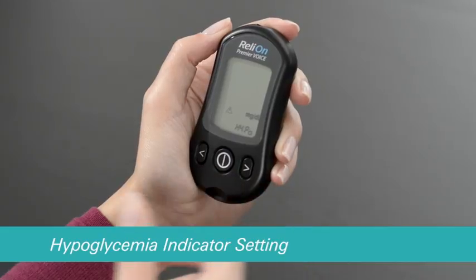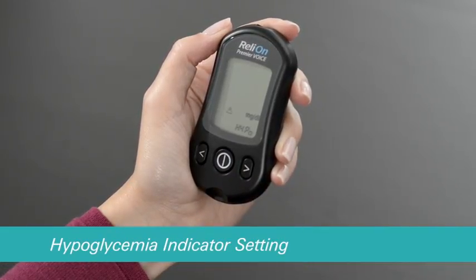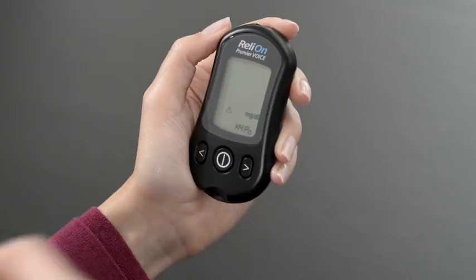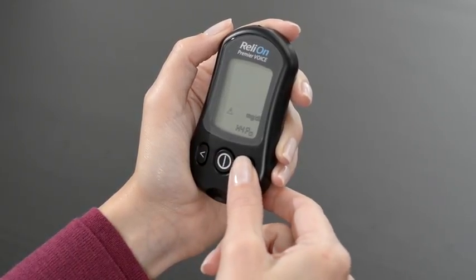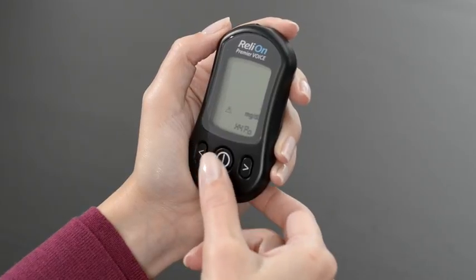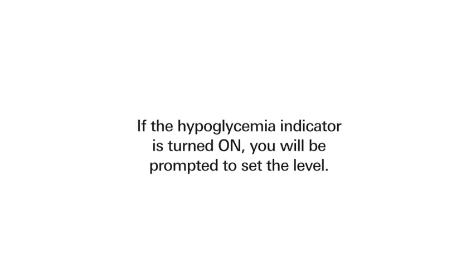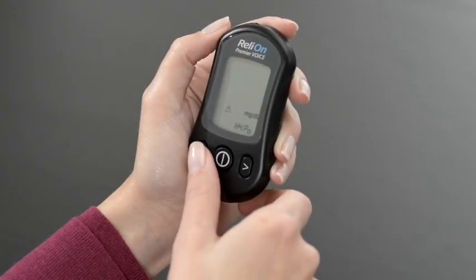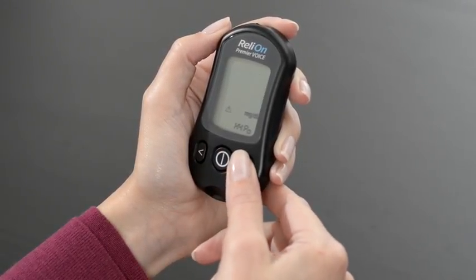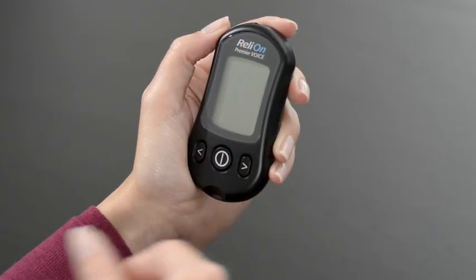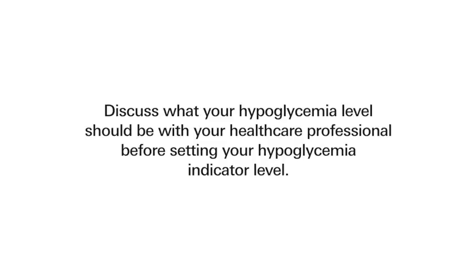Then press the center button to proceed to the hypoglycemia indicator setting. Use the left or right arrow buttons to turn on or off the hypoglycemic indicator and press the center button to make your selection. If the hypoglycemia indicator is turned on, you will be prompted to set the level. Press the left or right button to set the hypoglycemic indicator level. Discuss what your hypoglycemia level should be with your health care professional before setting your hypoglycemia indicator level.